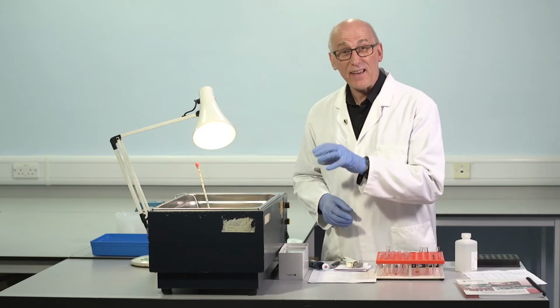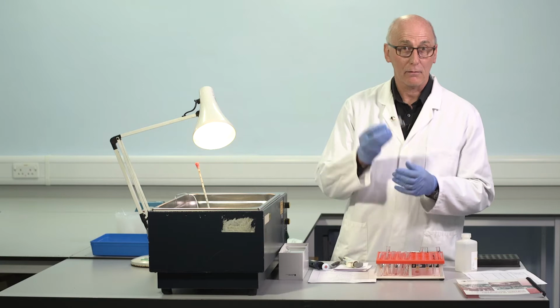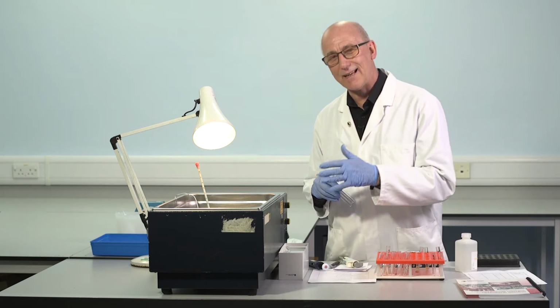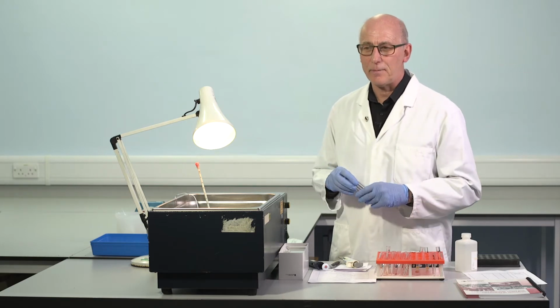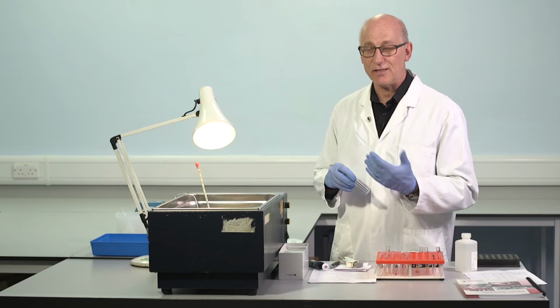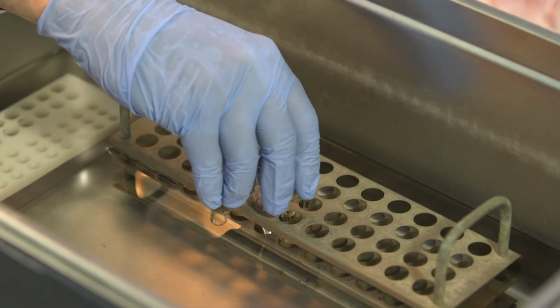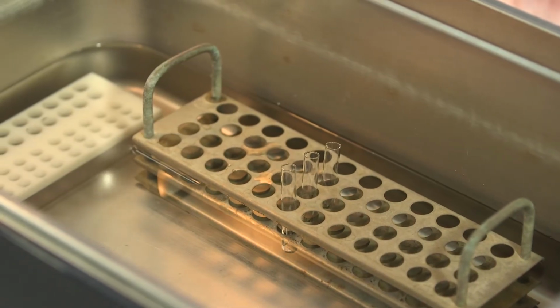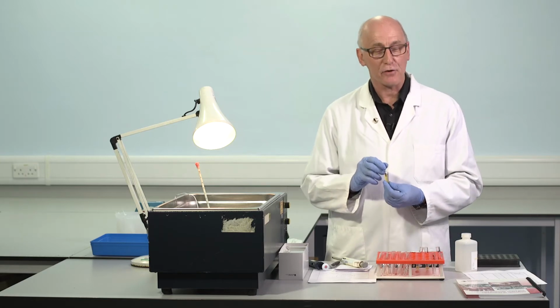So we're going to run effectively some APTTs on this mixture. So we'll do that with glass tubes. Although the dilutions are in plastic, it's better to use glass tubes for the clotting times. You'll see that we get better mixing in the tube, and it's easier to visualize the clot. So I'm going to need 3 tubes in here for these 3 clotting times. This is our factor VIII deficient plasma.